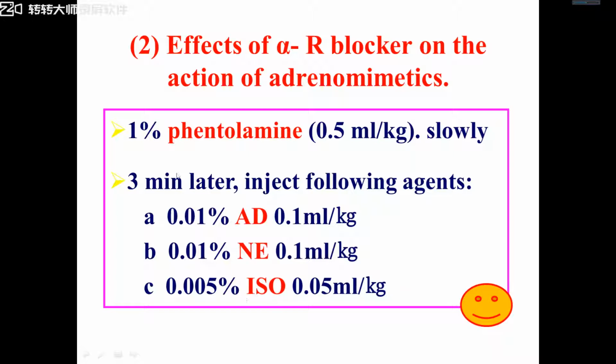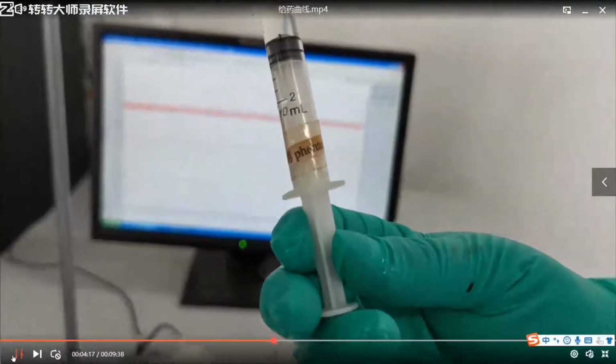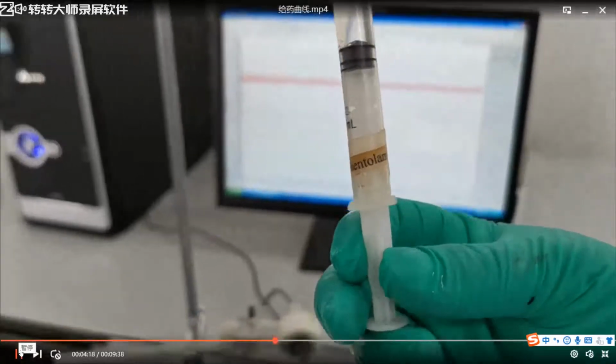Okay, let's do the labs. Let's continue our experiment. Let's give the alpha receptor blocker phentolamine. So this is the phentolamine, the alpha receptor blocker.